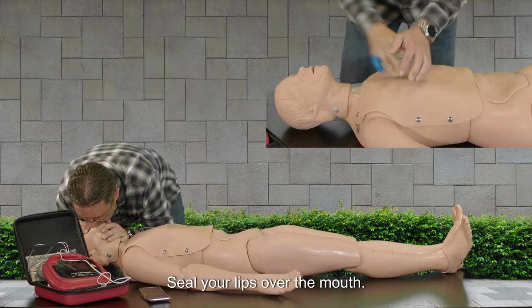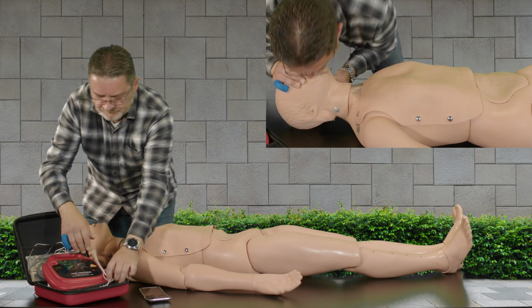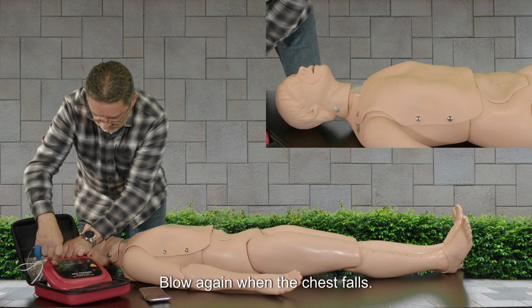Seal your lips over the mouth. Insufflate firmly until the chest rises. Blow again when the chest falls.